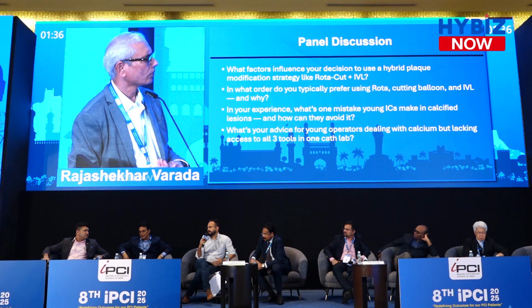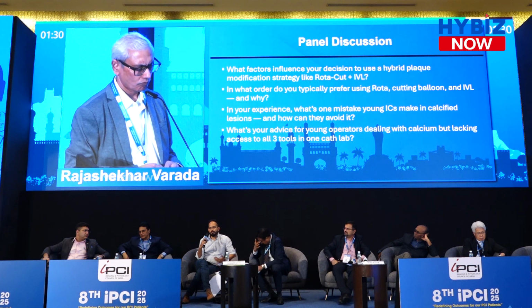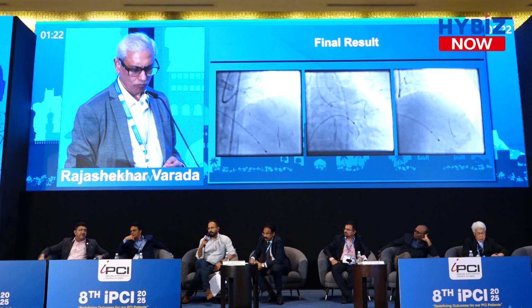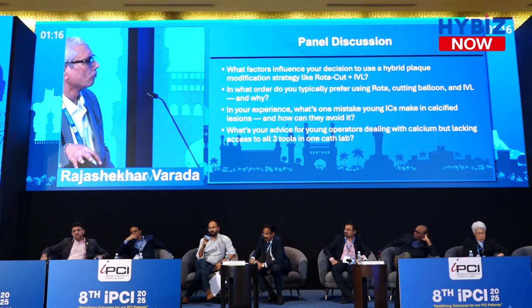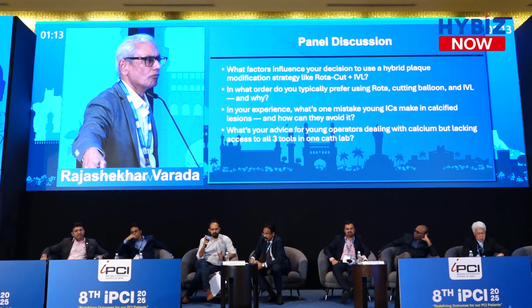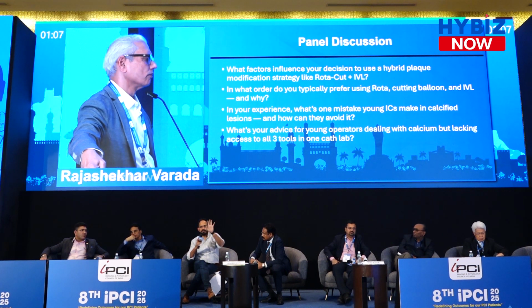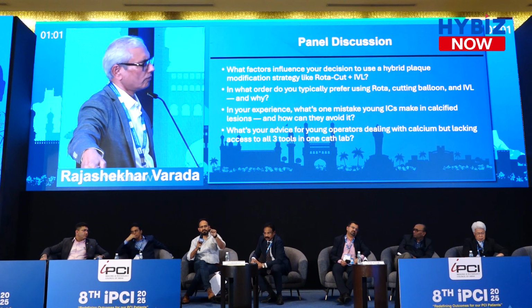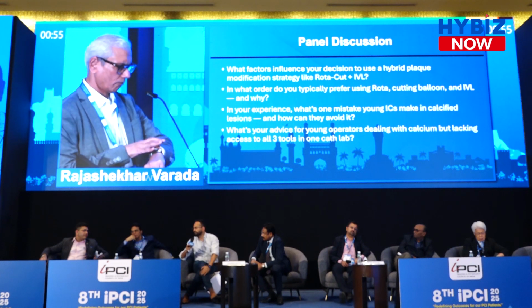And the second thing, try to achieve at least more than 10 millimeter square for left main MSA. If it is a large left main, it should be according to size. More than 10, your event rates are really low. If it is 12, 13, then it's practically nil. So that is what is important. The third thing, while pulling back the guide catheter, the stent deformation is very high in the left main position. So you must pay attention to the stent struts at the ostium of the left main. It's 9% or 10%, 1 in 10, you will have a stent deformity. Unless you are paying attention, a large stent deformity leads to an event. So these are a few points one should take care of.